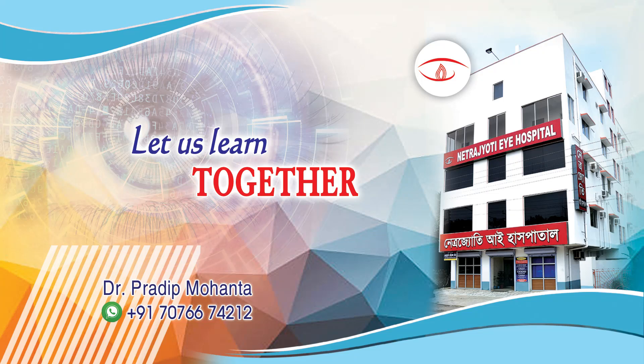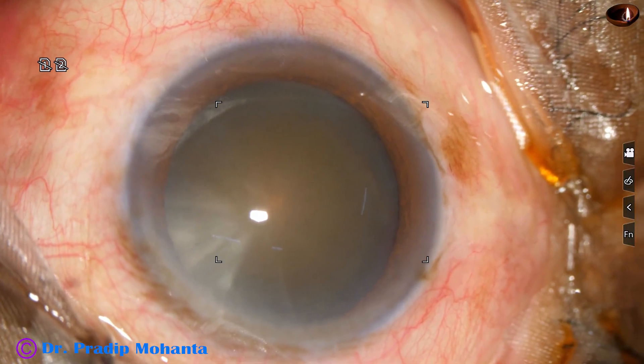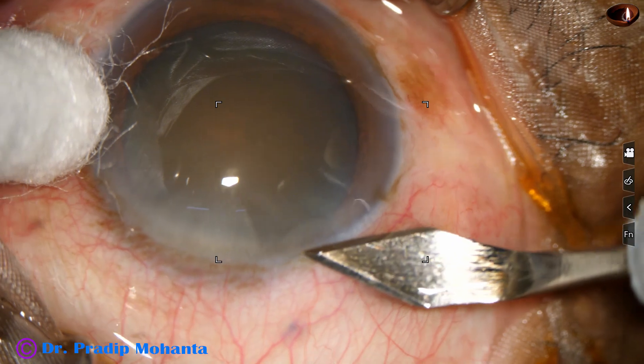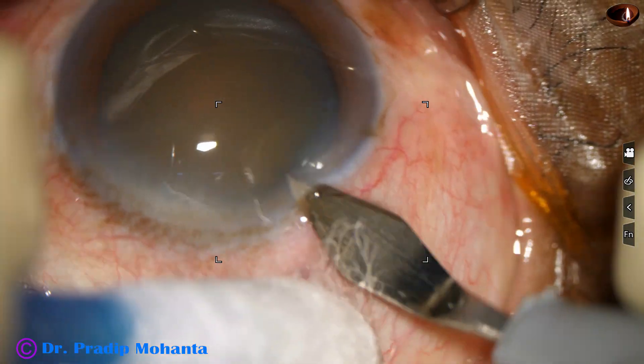Friends, welcome to my workplace at Ranaghat, West Bengal, India. This is a hard cataract. Nuclear sclerosis is about grade 4. Let us observe this surgery.